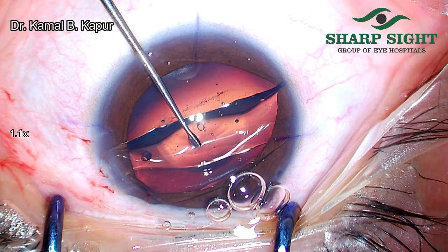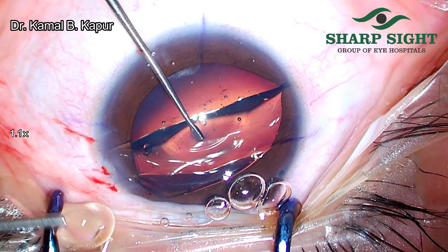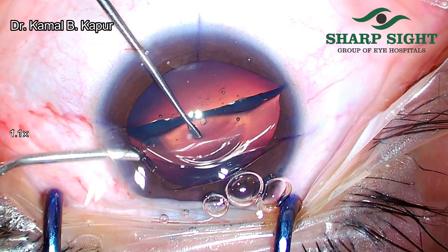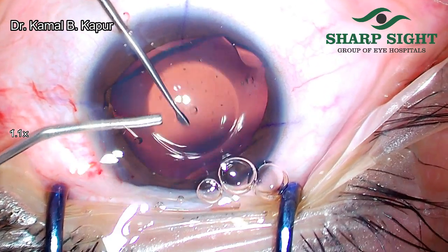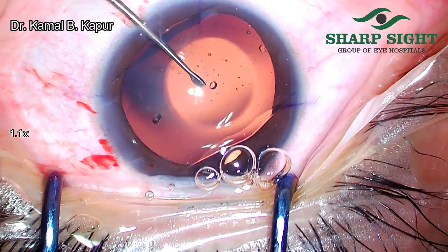Now, with the other hand — the main right hand — we go for the viscoelastic and make sure that we inject the viscoelastic within the unfolded ICL. Let's see this also in slow motion again.